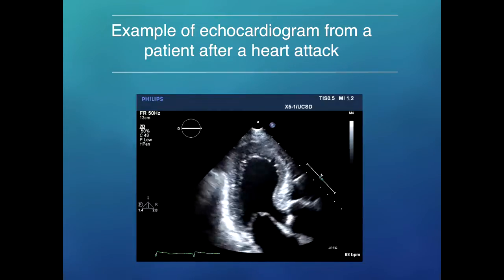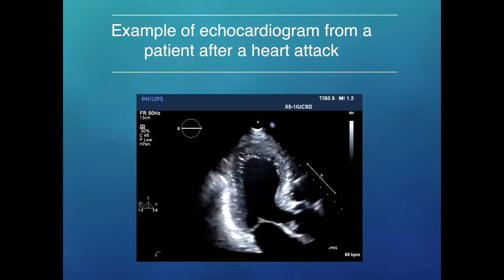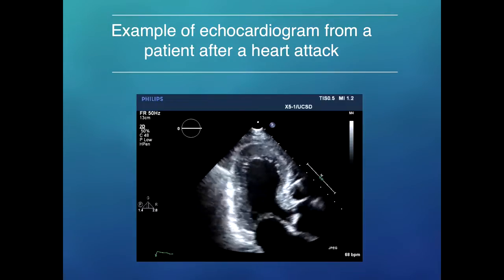And as a result of that, we can imagine that the blood flow pattern in this heart is going to be much different than that of the first heart. And as a result, there's an increased risk of blood having stasis in this area that doesn't squeeze normally. But again, we're not visualizing that directly. We can only try and infer that from these images.